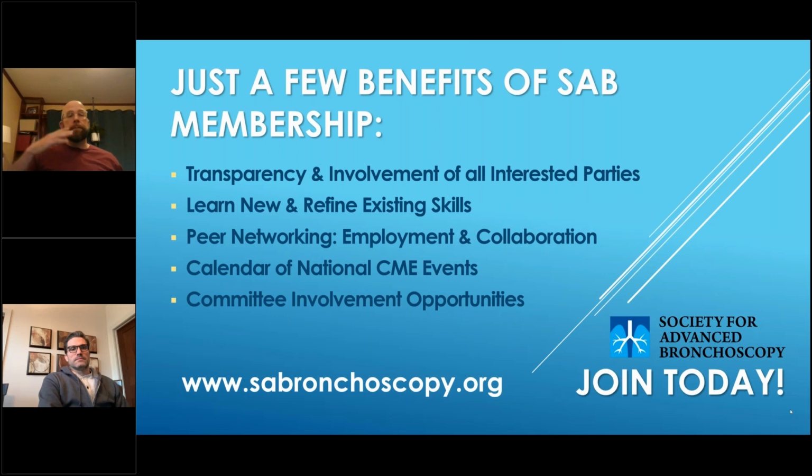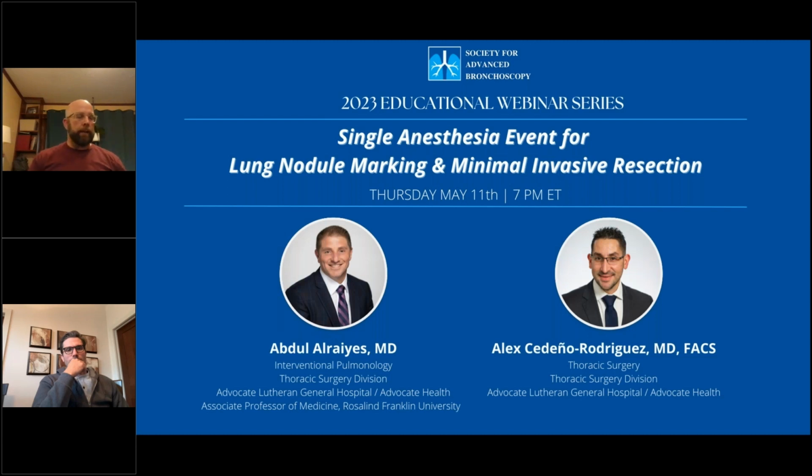And then the ability to do a spin is really nice. One of the analogies I think about is when I first started doing EBUS, back in 2006, when you saw that picture of that guy impersonating me on the original slide. It gave me a much better understanding of anatomy, where the blood vessels truly ran, where the lymph nodes actually sit, and the intersection of those. I think this has helped in that three-dimensional idea of where the airways go and how I need to configure not just where my catheter sits, but more importantly, the trajectory of that catheter.